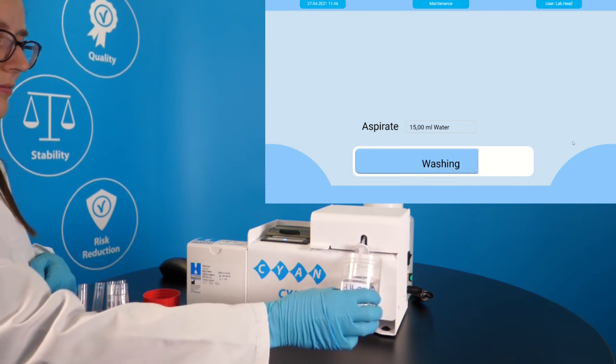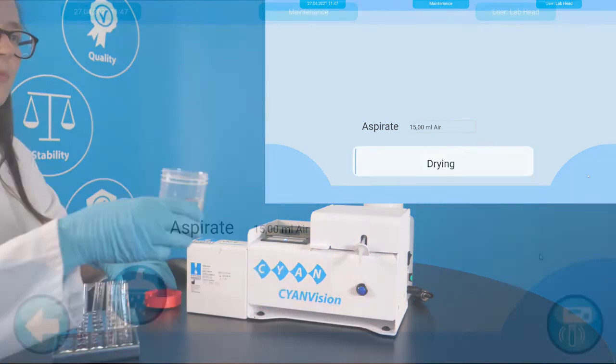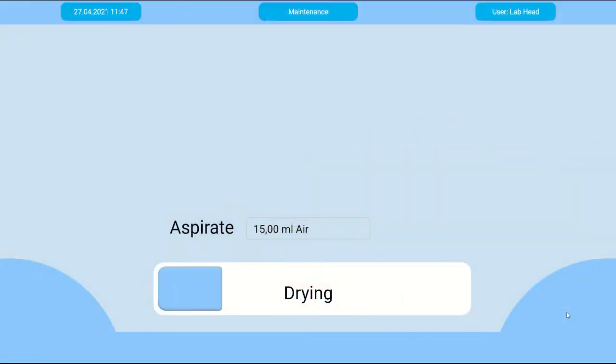For this washing step, you need 15 ml of distilled water. Finish the procedure by aspirating air.